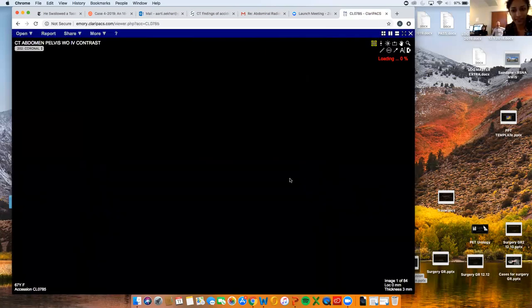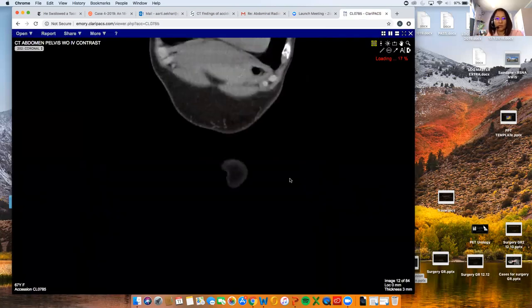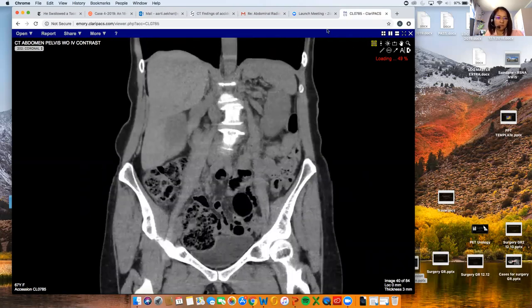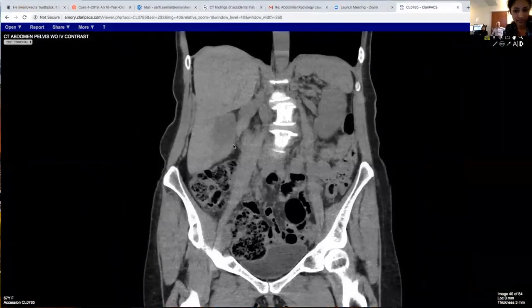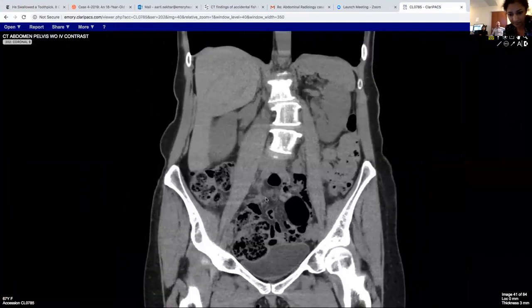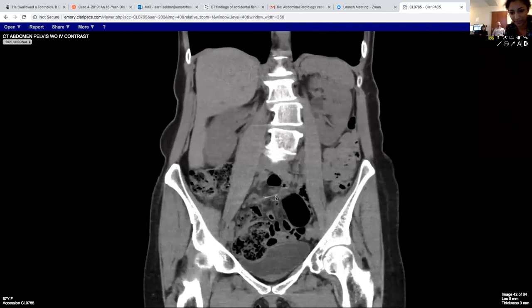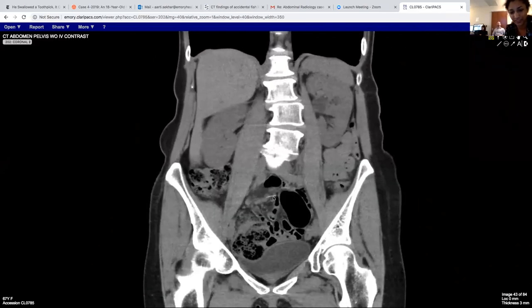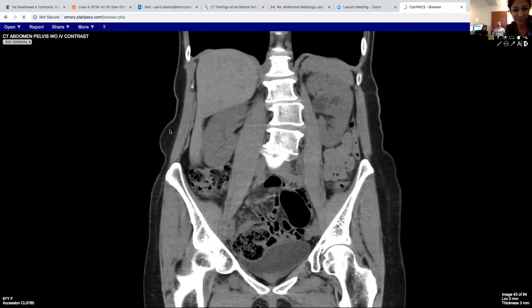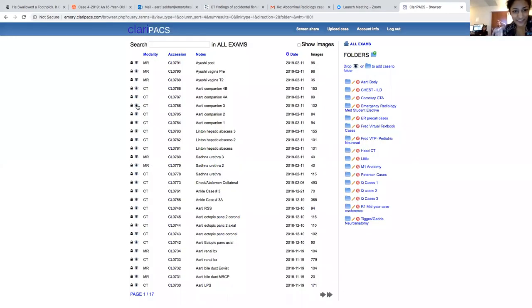Here is another companion case. Here was another one that actually on the axial you couldn't see it — Amir picked this up. It was a fish bone just sitting in the mesentery with a little bit of stranding around it, maybe poking out of a little small bowel. And then here is another one.